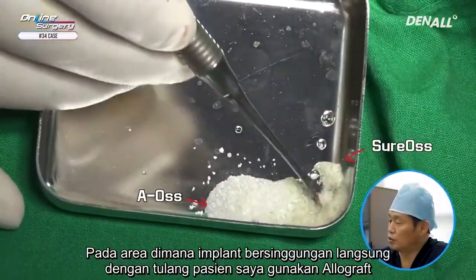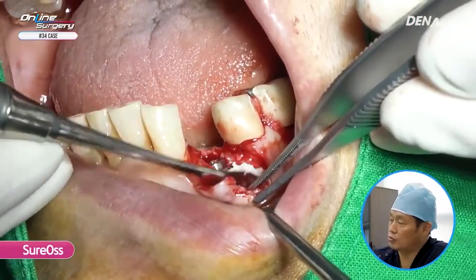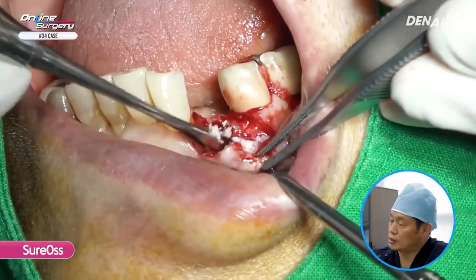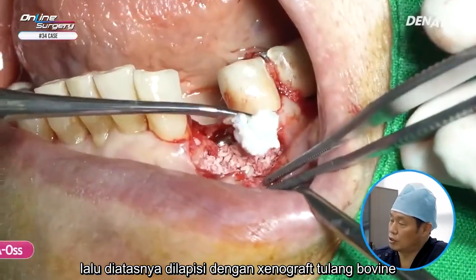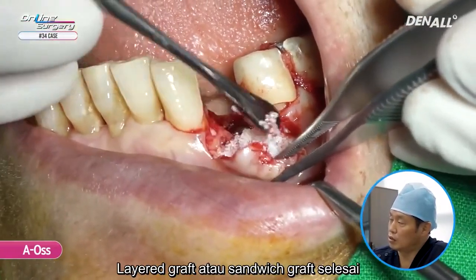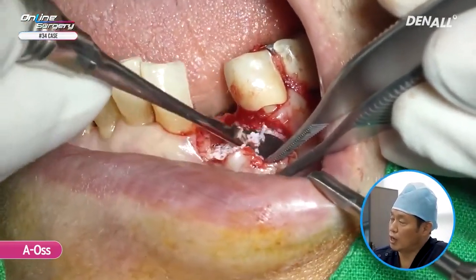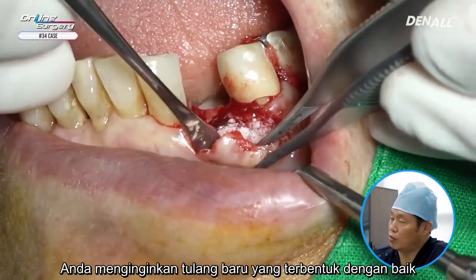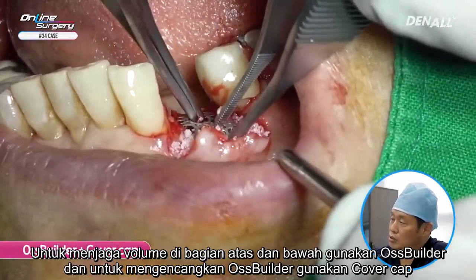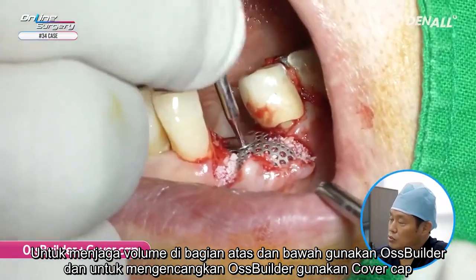In the area where the implant is in contact with the host bone, I use allograft first. And then on top of it, I'm going to layer it with xenograft or bovine bone. Layer graft or sandwich graft is done. So you want new bone formation to be done nicely inferiorly, and on top of it, in order to maintain the volume, OssBuilder is going to be used.